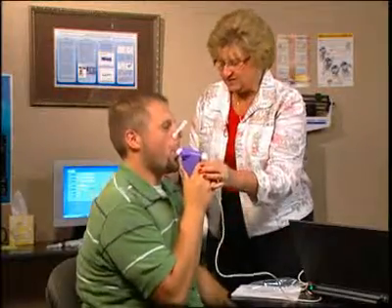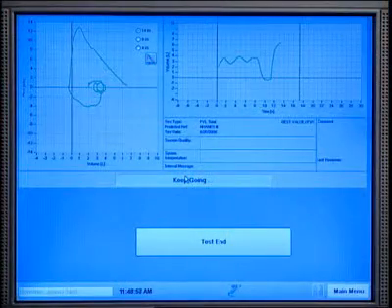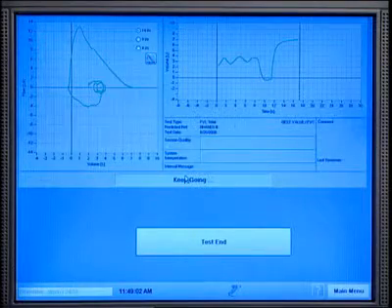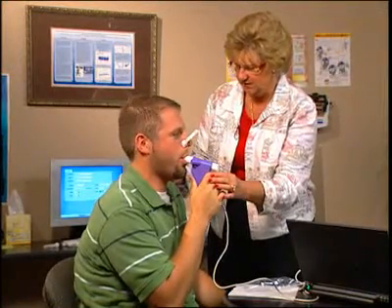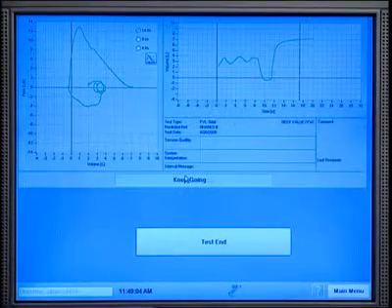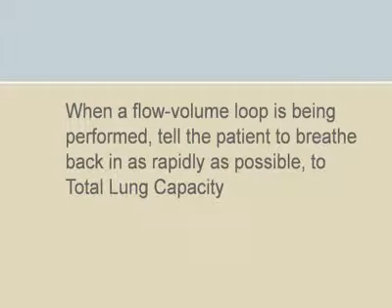Instruct the patient to blow out hard and fast as you observe the graphic displays. The patient should not hold his or her breath at total lung capacity. Next, instruct the patient to continue to squeeze all the air out for at least six seconds and until the volume-time curve shows at least a one-second plateau.